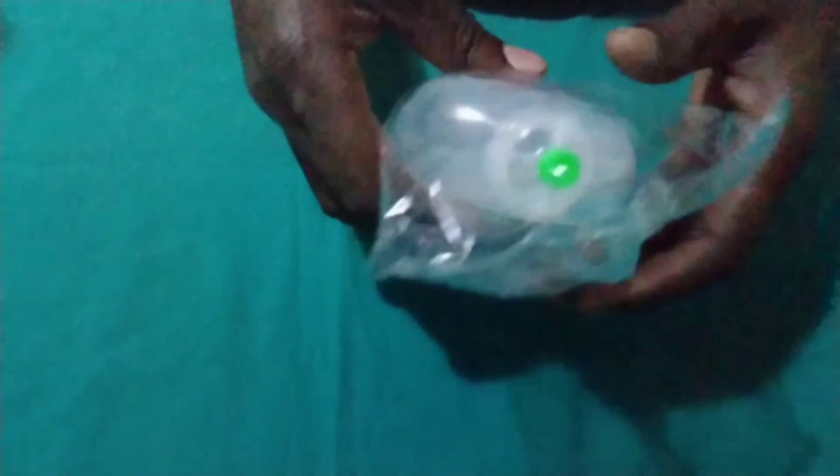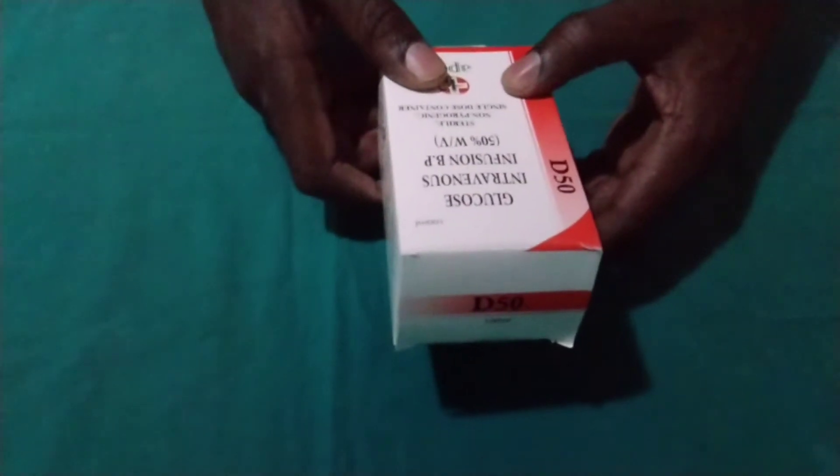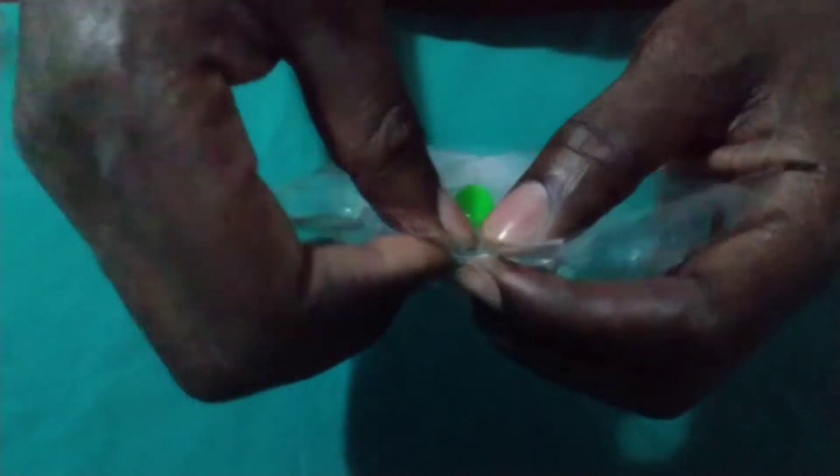What we are going to do, we are going to aspirate 50 mils from here and we are going to replace with 50 mils of dextrose 50%. So let's start by aspirating. We are going to use 50 mils — you can even use 20 mils or even 10, depending on what is available in your facility.